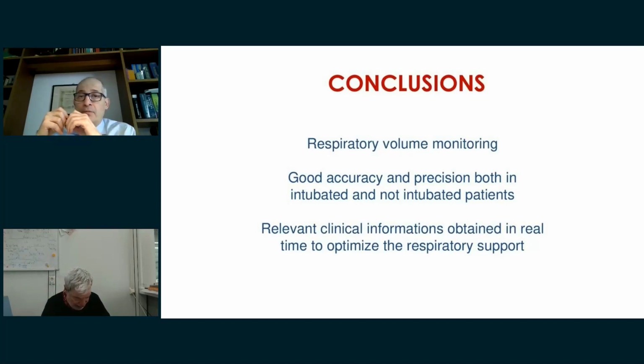You are looking if there is any other. Yes, there is. Okay, what is the point of knowing the inspiratory effort? We already spoke about it. Is calibration required for monitoring? No, there is no need for calibration.